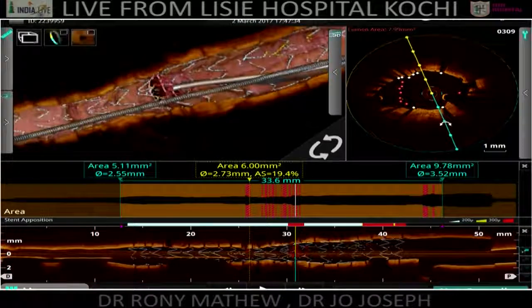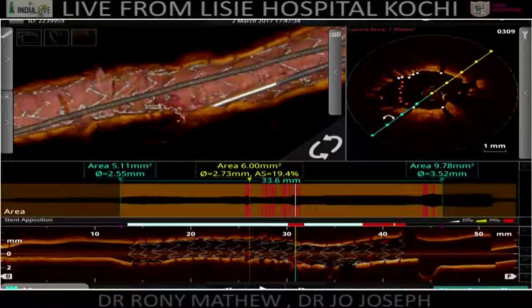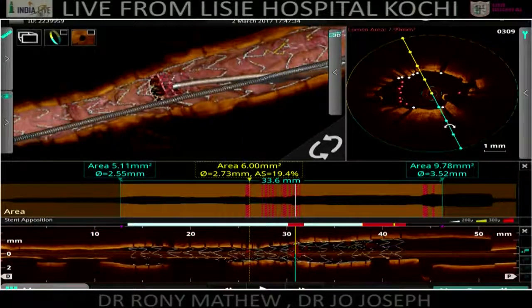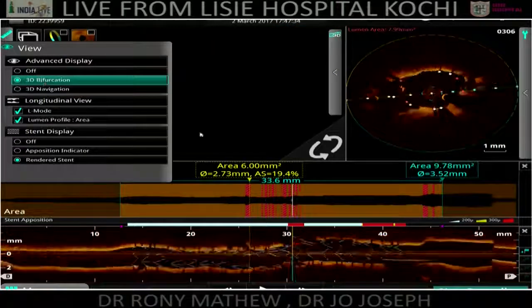Now, can you please rotate it a little bit more so you can see where it is going. If you realize it's going from the proximal part. You can see it going from the proximal part of that side branch. But of course, if you take that bifurcation point, you can see it a little better. Take the bifurcation and go to full screen.